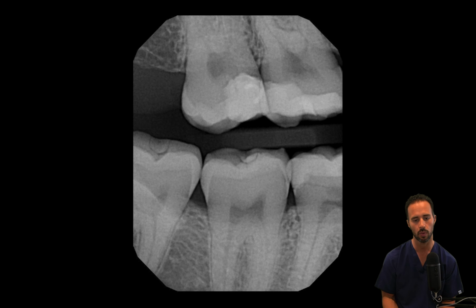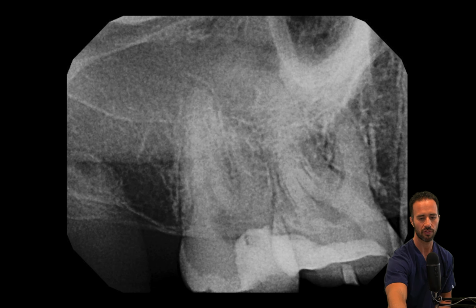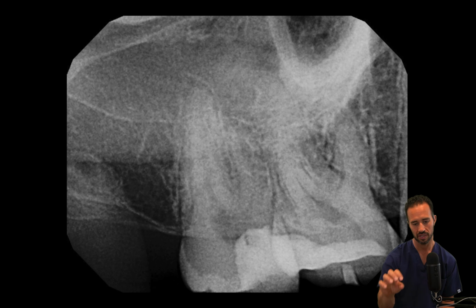And when you look at the bite wing radiograph, you can see how deep that restoration really is in terms of its proximity to the pulp. And when we examine the periapical film, we can also appreciate that that MO composite is very, very deep. Also, I want you to appreciate that the pulp chamber appears to be open and we can make out some canals inside the roots. So we feel good that we're likely to have a very successful outcome for this patient.